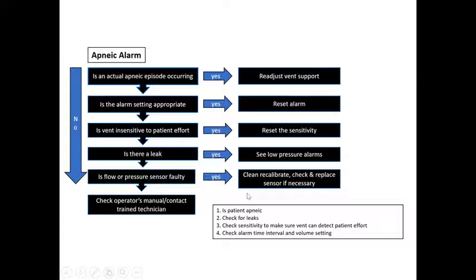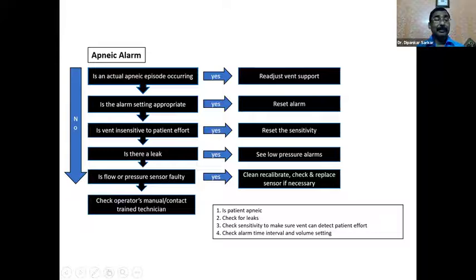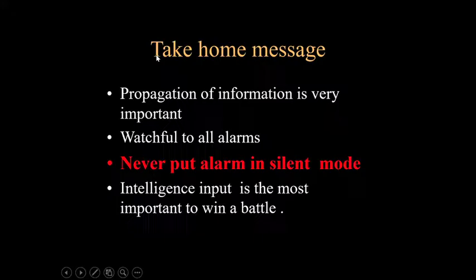Apneic alarm. If it's an actual apneic alarm, readjust the ventilator support. If the alarm setting is inappropriate, reset the alarm. Is the ventilator insensitive to the effort? Apneic alarm may be there if we put the triggering sensitivity at such a value that the ventilator becomes insensitive. So you have to reset the sensitivity. If there is any leak, see the low pressure alarm and adjust accordingly. So these are the alarms you have to see.